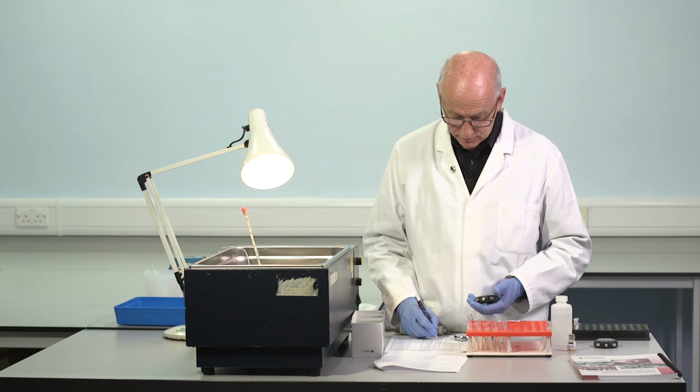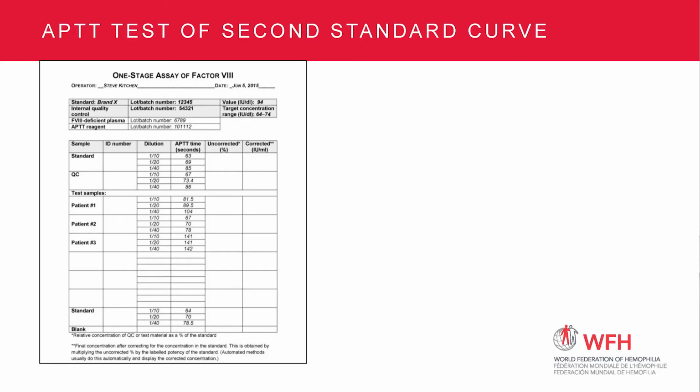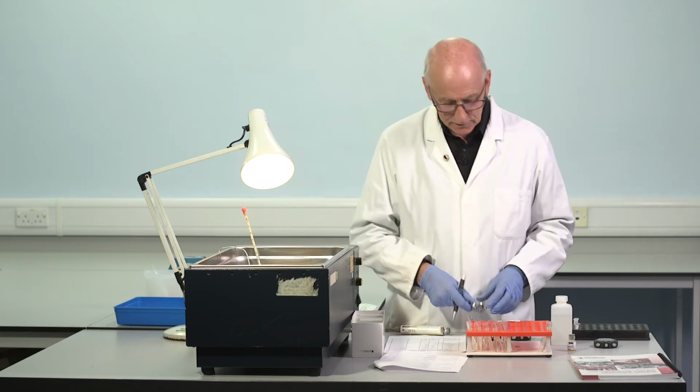Again, 1 in 10 dilution, 1 in 20 dilution, 1 in 40 dilution. And the 1 in 10 dilution at the end, 64 seconds. If you remember, at the beginning, 63. The 1 in 20 dilution, 70 seconds. At the beginning, 69. The 1 in 40 dilution, at the end, 78.5 seconds. Now the one at the beginning was 85. So that's really quite a different clotting time.